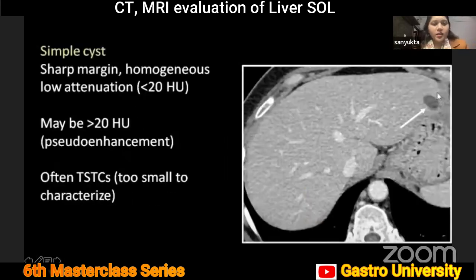The cystic lesions I'll just skip, as Dr. Hira has talked about them in detail. Just a few points about it. How do you know that it's a hypodense or cystic lesion? You have to measure the HU. It helps us many a time, but not always. If it is less than 20 HU, then you are confirmed that it is mostly a cyst. So you don't send the patient again for an ultrasound to characterize whether it's solid or cystic.